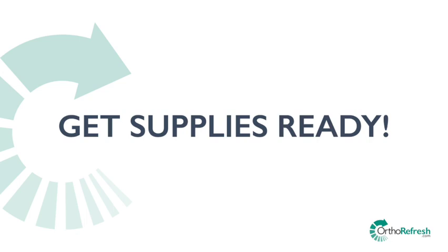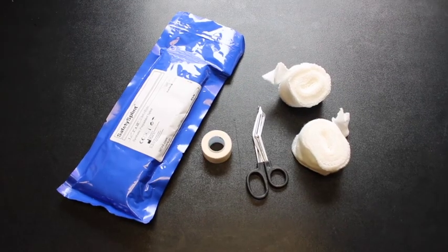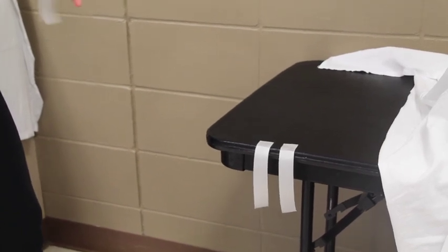Materials needed: a thumb spica splint from a home medical store or a ready-made splint, scissors, 2-inch padding, tape, and a 3-inch elastic bandage. Tear off some pieces of tape so they are within reach at the end of the splint application.